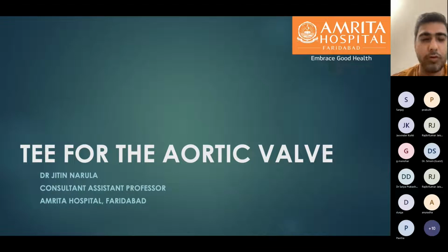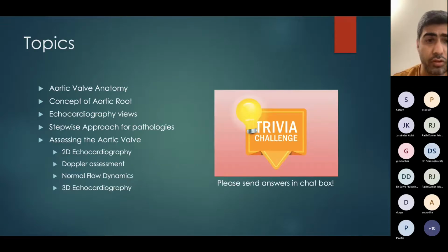So here's the topic for today's Sunday session: aortic valve assessment by TE. The topics which will be covered over the next 30 to 45 minutes are anatomy of the aortic valve, the concept of aortic root, various echocardiography views which are used to evaluate the aortic valve.